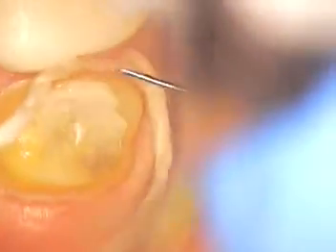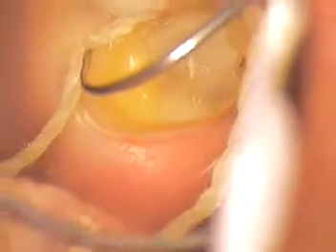Cord that goes in, and basically this has been rinsed thoroughly. We don't want anything impregnated inside of this material. I got an allergic reaction to Hemodent, and so you see that facial can't even hardly pack it. There's hardly any sulcus there. That's why I ended the margin right at, literally at the crest. There's nothing to pack in there. Gold instrument, please. Nothing in there to pack.